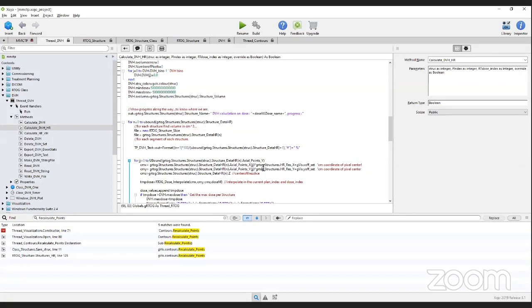I think also that, I mean, the CT image has a specific resolution. So it does not make sense that you try to calculate a DVH with a resolution smaller than the CT image, because then it's going to interpolate things. I don't know if that value then is going to be closer to the true value or not. So I tend to agree with Andrew that the best possible thing you could do is to calculate your DVH with the same resolution as your CT images.